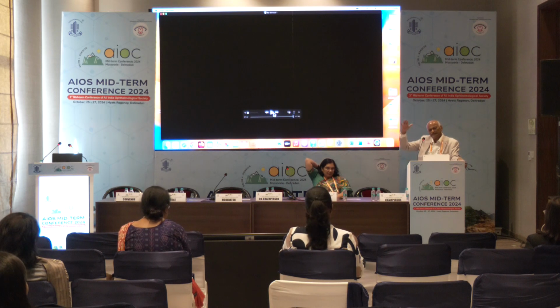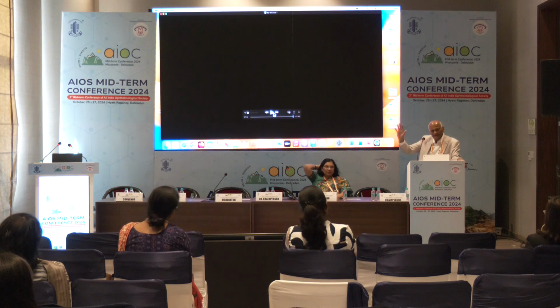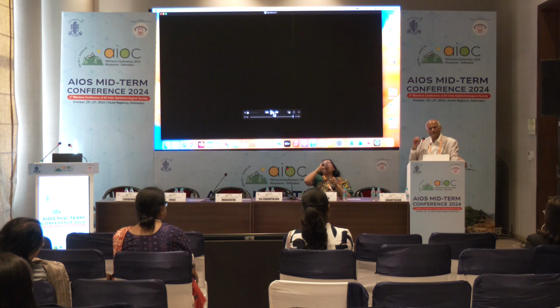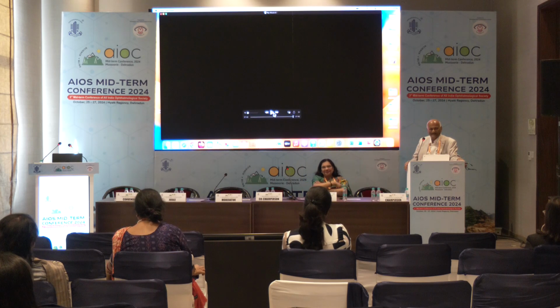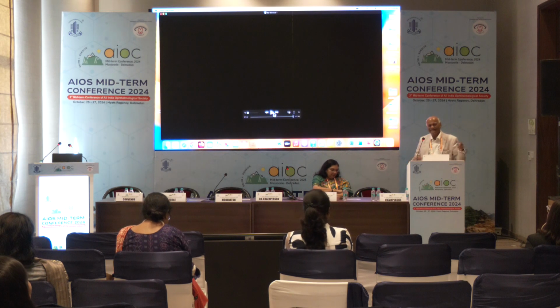We should try only low phaco powers, low vacuum, everything low. And another thing is the surgeon should be slow. Here the surgeon should not be a fast surgeon. If the surgeon is fast, he will definitely do the phacoemulsification, but in the vitreous, not in the anterior chamber, the lens will be in the vitreous, and then he will have to call the retina surgeon, and that retina surgeon will help him.